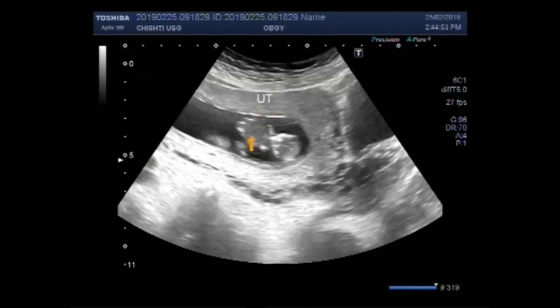So you can see this is the fetus — a fetus of about 10 weeks, 5 days.